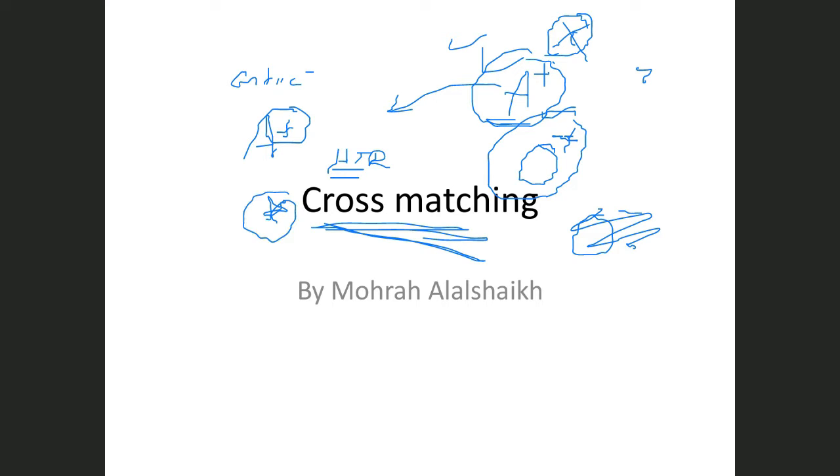Yes, Nora. I see the reaction between the donor's red cells and the patient's plasma. Excellent. Okay. We want to see if the patient has an antibody against the donor cell. So here I will use red blood cells, and here I will use the plasma.